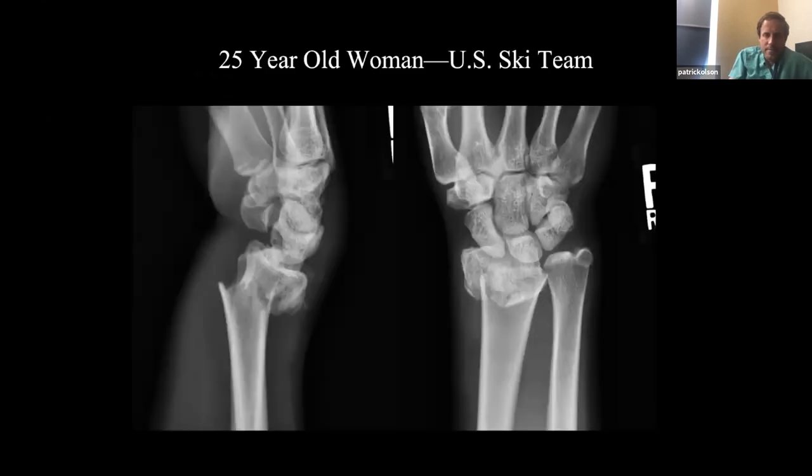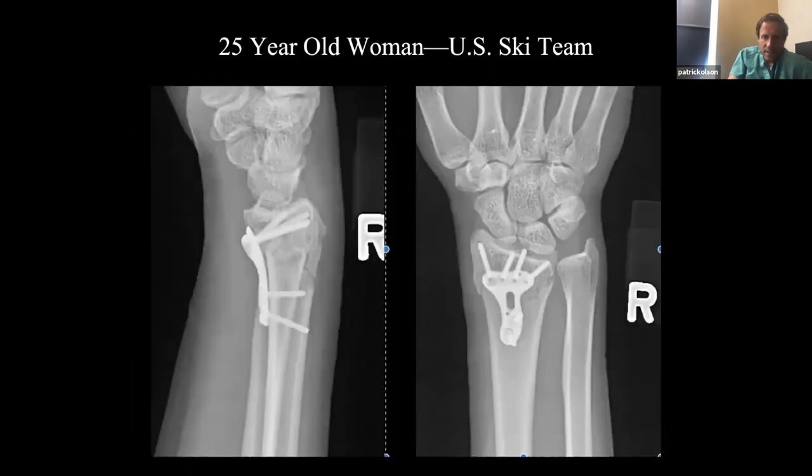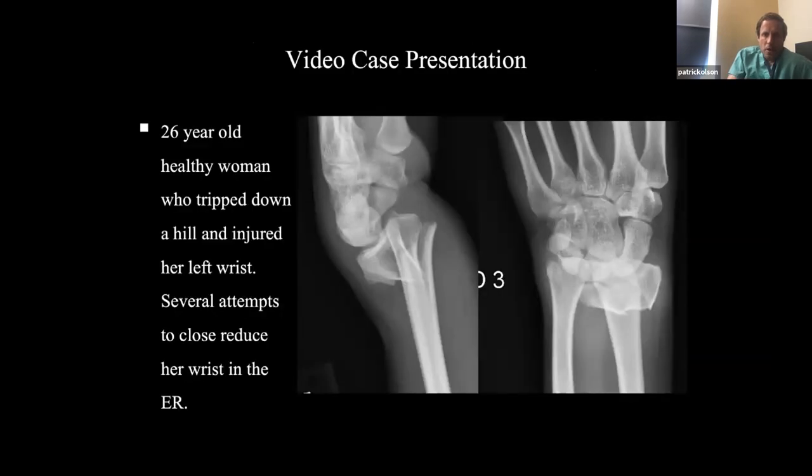Here's a 25-year-old woman on the US ski team. Here are her post-reduction films — you can still see she has some dorsal translation. Here's her post-op incision: one and a half centimeters. This is a woman I just saw this week — three months post-op — and she was bragging and showing off her scar to all her friends who also had scars two to three times the size.